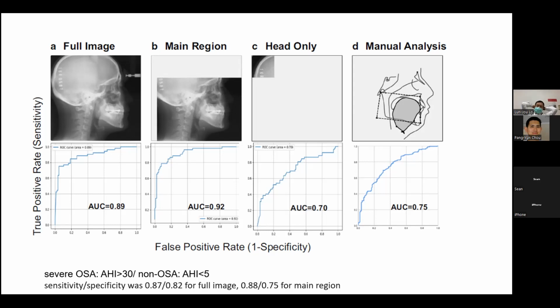So from the previous study, I would suspect that if you look at only the skeletal frame, the accuracy may not be as good as this 2D cephalometry evaluation. So I would recommend you to include the pharyngeal airway first, at the first stage. Okay. And then you can expand. If you worry about the power of the computer, you can extract the STL file of the pharyngeal airway, and then do some study first, and then you expand to skeletal parts.